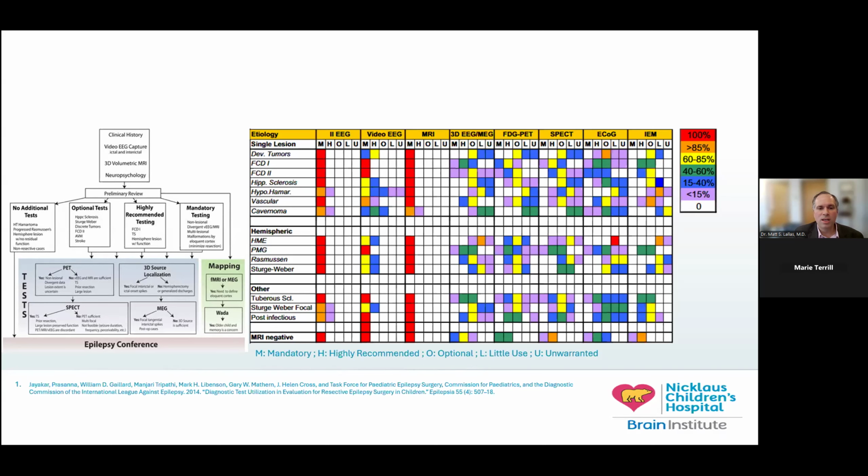And as you take a look within the different pathologies, you'll find a variety of opinions, and there are some times where it's saying that, yeah, we really don't think that it's warranted, like potentially hippocampal sclerosis. But in those scenarios, I would argue that there's still information that we could potentially garner from this, and that might be helpful towards our understanding of the whole network. But sure, we might not find our spikes on the hippocampus just from our scalp EEG.